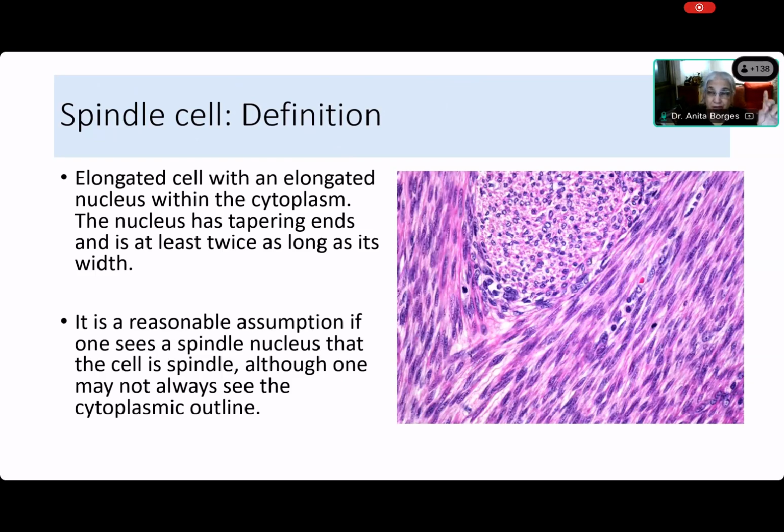Now, it is a reasonable assumption that if one sees a spindle nucleus, the cell itself is spindle. And I think that is what Elsa was trying to say, that a spindle cell should be defined not by the fact that it is elongated, but that it has an elongated nucleus, although one may not always see the cytoplasm. All right, Shashank?